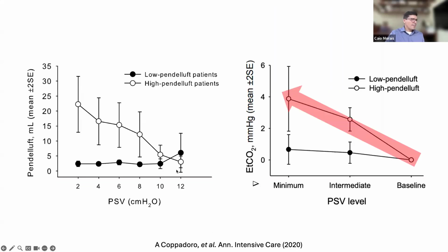They found that the amount of pendelluft was higher in some patients, and the amount of pendelluft increased when pressure support was reduced. For some patients, we know when we reduce pressure support, they feel the necessity to increase the inspiratory effort, and the amount of inspiratory effort that this drop in pressure support may produce may justify the increase in pendelluft in the sample of patients.